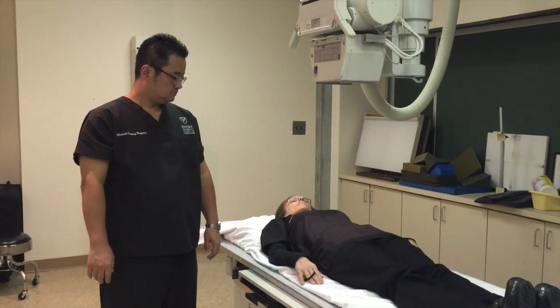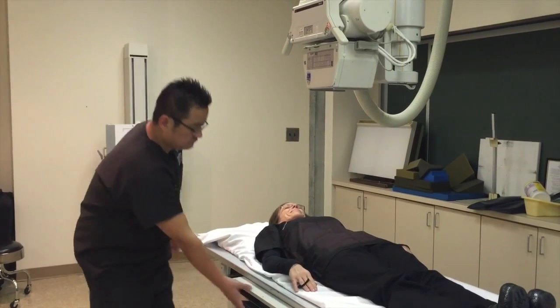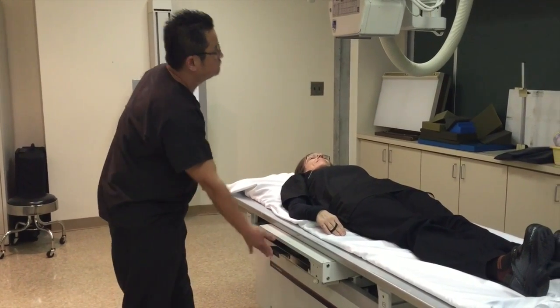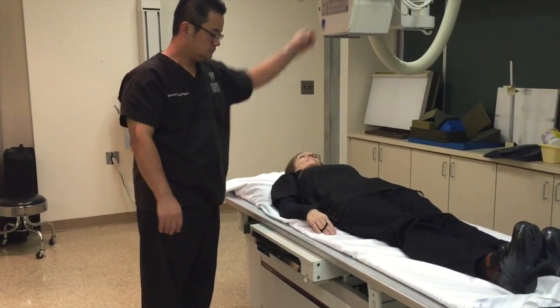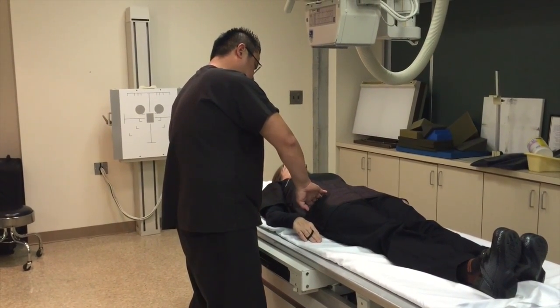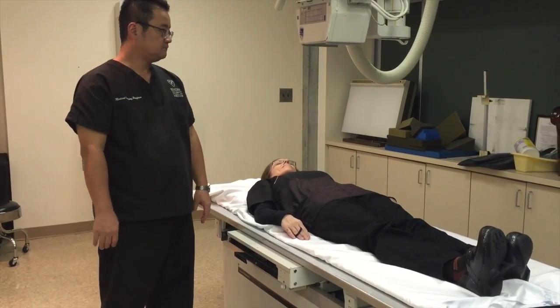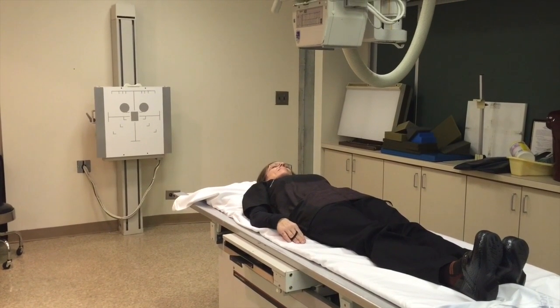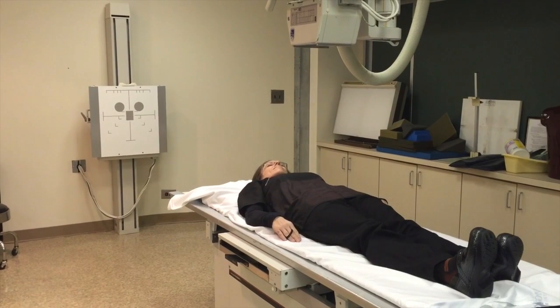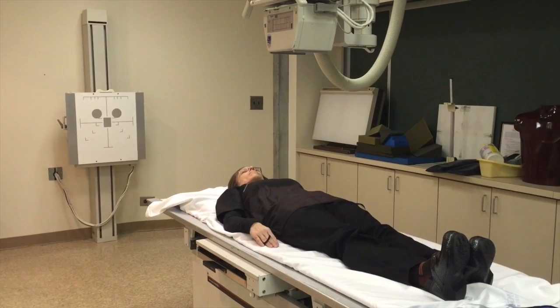The technologist will then take a 20-minute KUB. He will position a 14 by 17 IR lengthwise with the right marker in the bottom corner. He will have the CR centered at the level of the iliac crest and mid-sagittal plane. He will set technical factors of 80 kVp and 25 mAs, then give breathing instructions: deep breath in, blow it all the way out, and hold it out. Breathe.